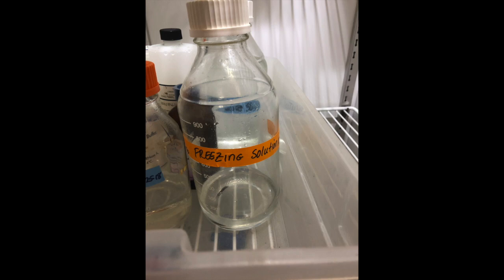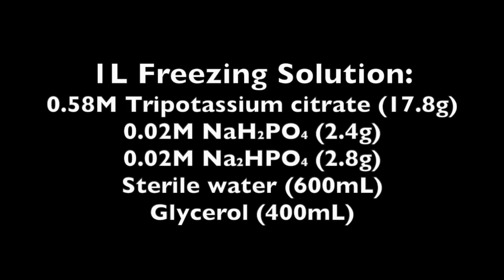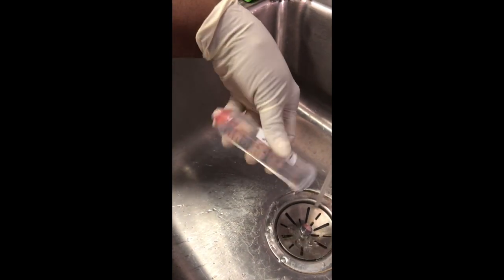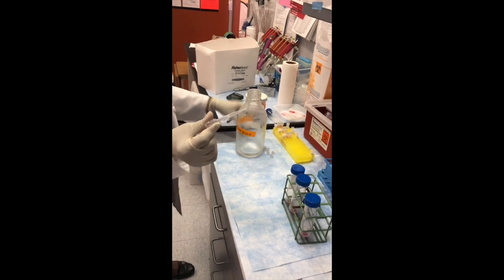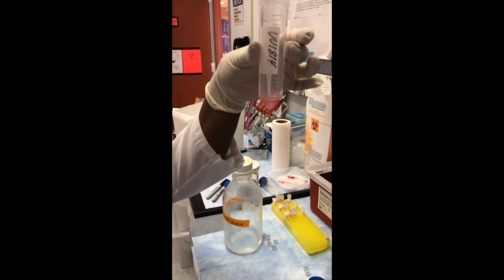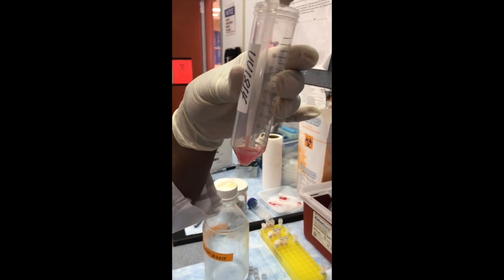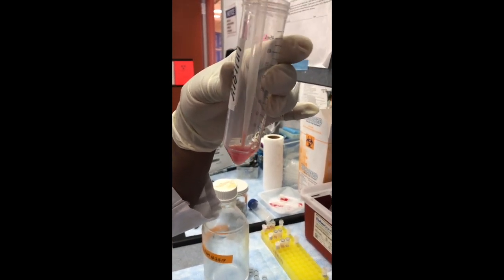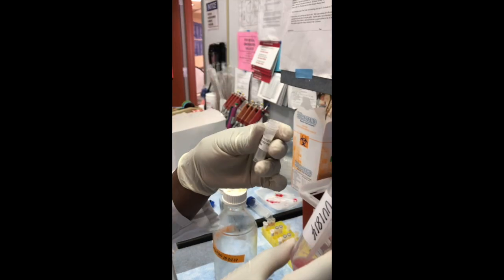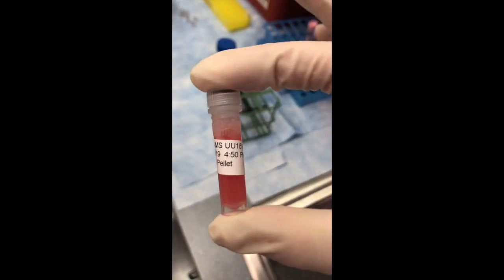In the next step, the pellets will be re-suspended in 1 milliliter of freezing solution. Freezing solution is pre-made according to this formula and is stored in the refrigerator at 4 degrees Celsius. Tubes will then be removed from the centrifuge and taken to the sink. With cold water running off to the side, the supernatant will be decanted into the sink without losing the pellet. Now that you have a pellet, you can add 1 milliliter of freezing solution. The pellet and freezing solution will be transferred to the 2 milliliter labeled tube. These 2 milliliter tubes will be labeled with sample ID and BC for buffy coat.